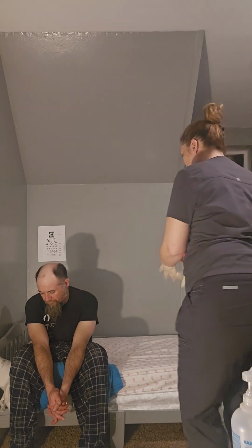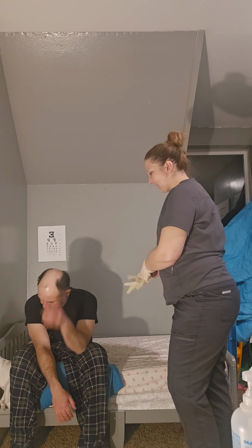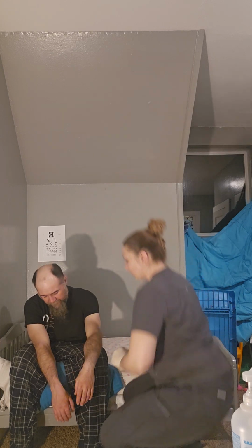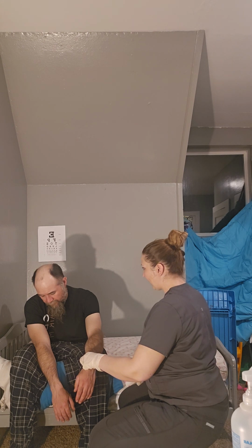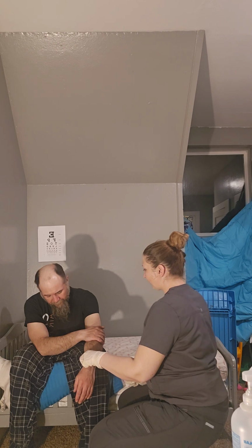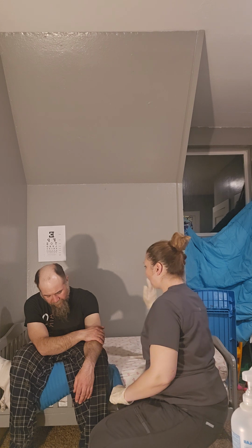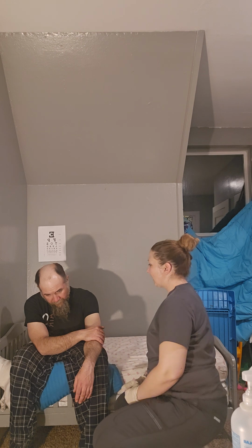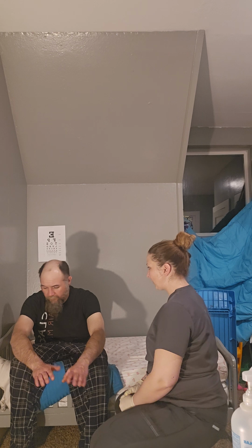So first I'm going to get a full set of vitals. So my temp is 97.5, tympanic is how I would chart it. Pulse, counting over a minute, I got 80 beats per minute. Regular rate, 2+ on radial. And then respirations, I would count over a minute, 16 respirations.